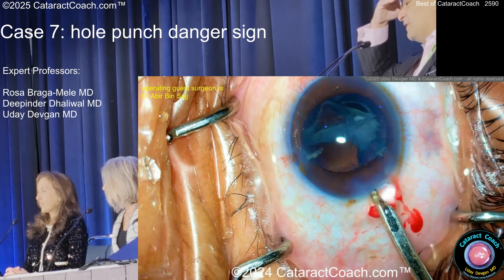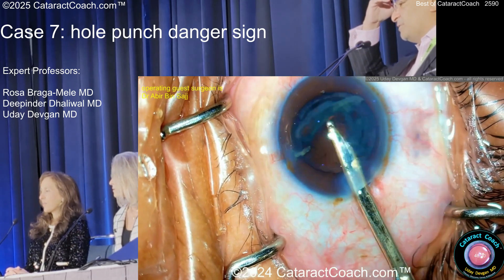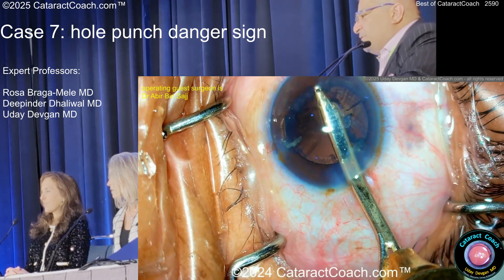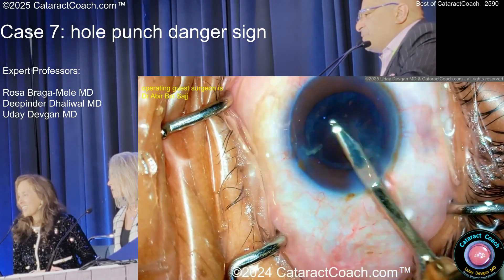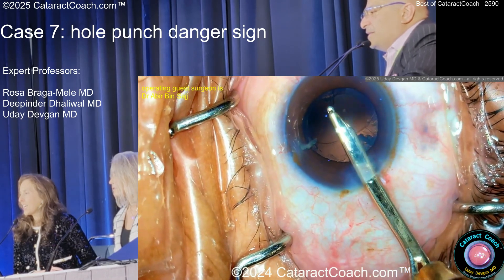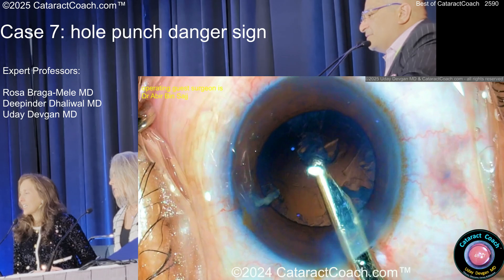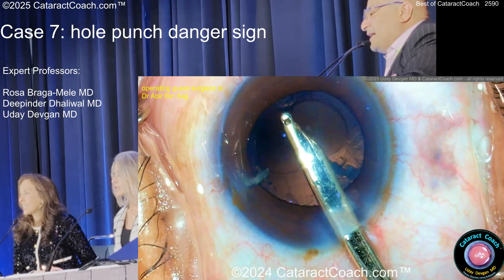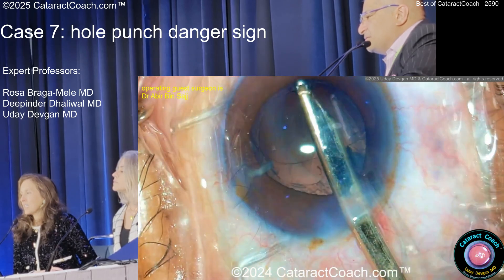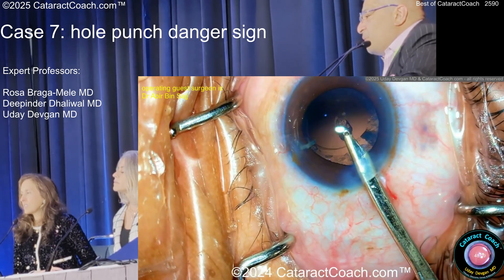The surgeon pulled out of the eye, didn't follow that advice. Now using a Simcoe cleaning this up. Remember how small the hole was because it was made with a phaco tip — what happens when the hole gets bigger? You'll see the hole is a lot bigger now. Why is the hole bigger? Because the anterior hyaloid face broke. If you pull it, that's vitreous stretching out that hole.